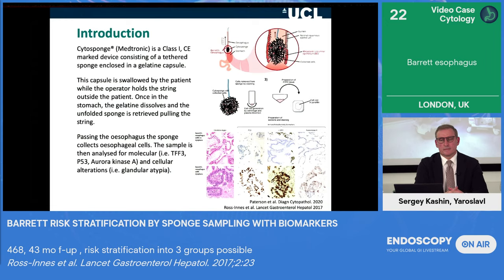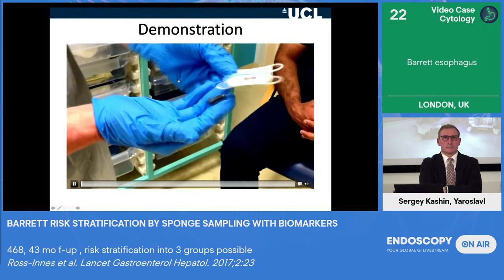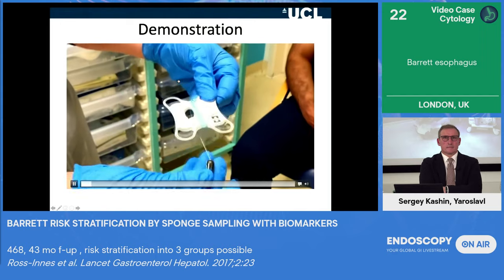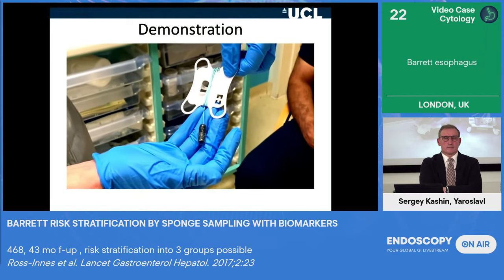It is a capsule which is swallowed by a patient. It has a gelatinous capsule. It dissolves in your stomach, and then we pull it up, and it brings up a representative sample of cells that are indicative of not just Barrett's with TFF3, but also cellular atypia and P53. So we couldn't get a live patient for you today, so we had to hire in a male model to demonstrate. So this is what would happen in real life.